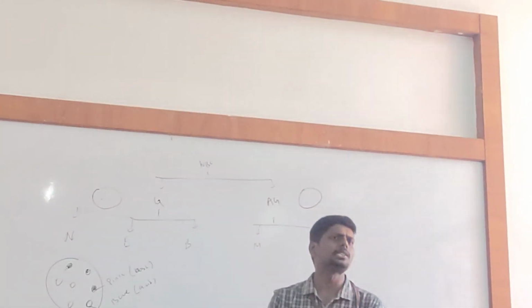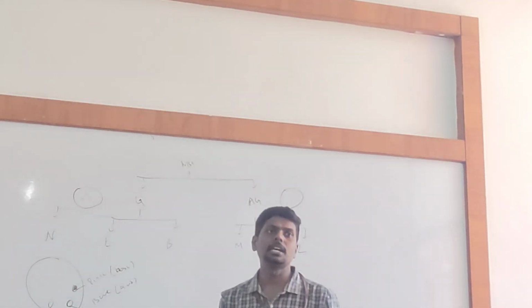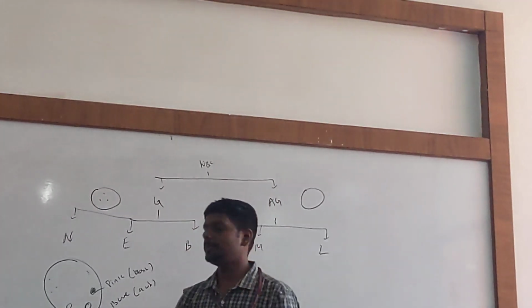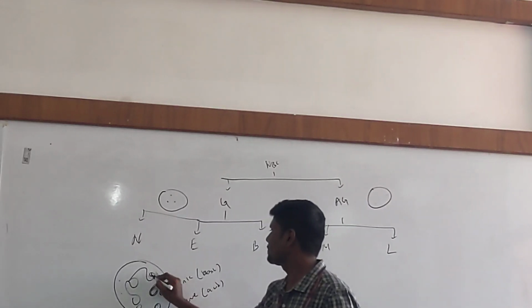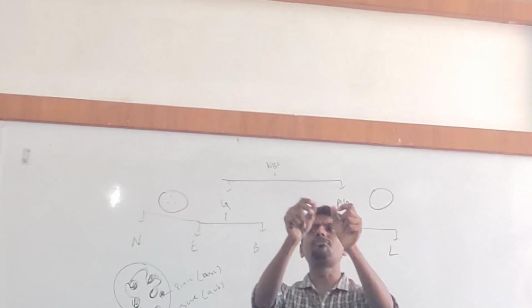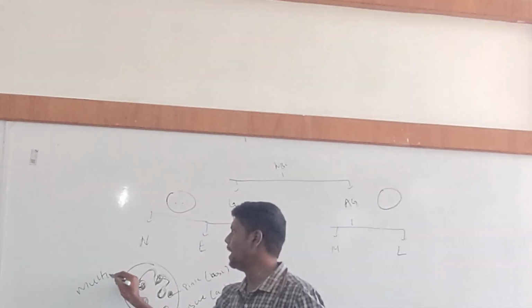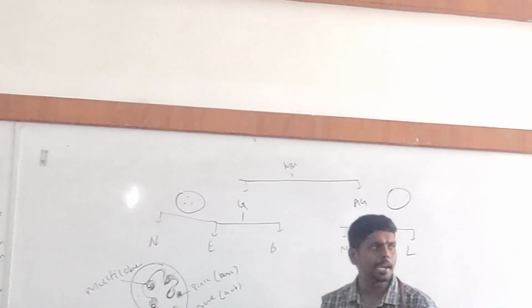Then coming to the nucleus of the neutrophil. The nucleus is very important to identify the type of cell. In the case of our neutrophil, the nucleus is multi-lobed. The nucleus has multiple lobes like this, multiple foldings. Okay? Neutrophil has multiple lobes. A multi-lobed nucleus is present.